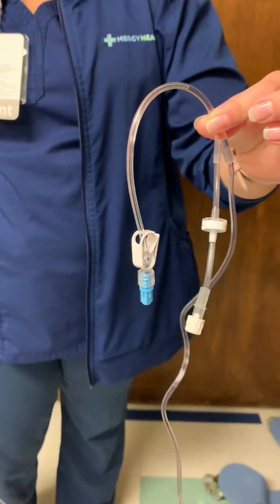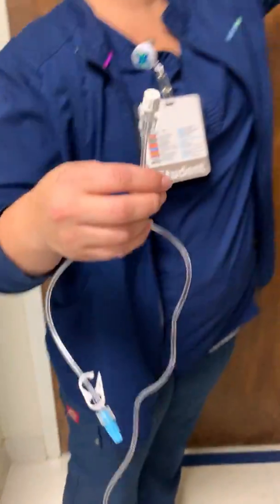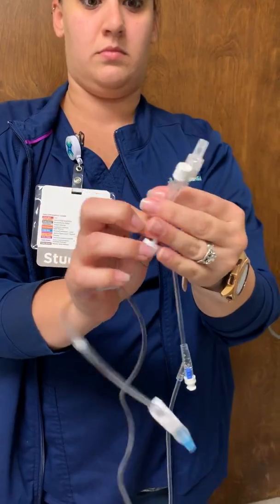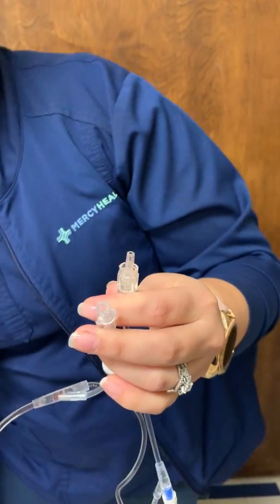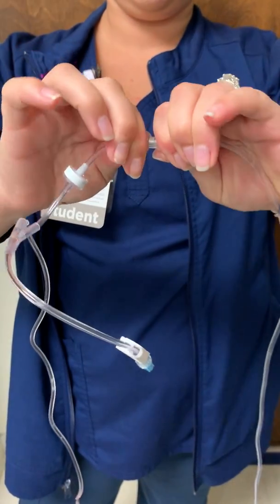So the next thing we have to do is attach the primary tubing to the Y connector of the PCA tubing. Of course, you get your PCA tubing, maybe from Central or maybe from your stock. You have to do it this way. You cannot plug the PCA tubing into the primary tubing. It must be this way around.